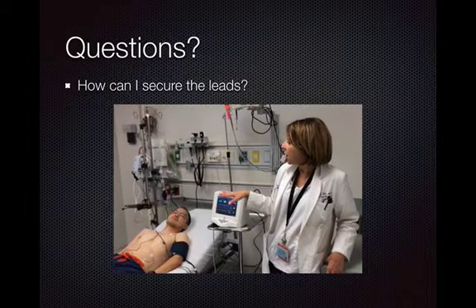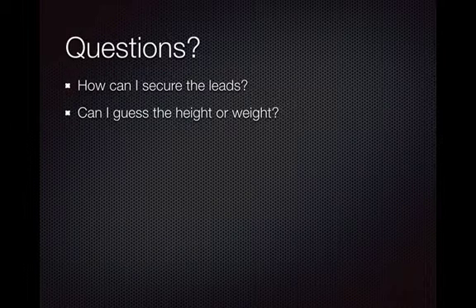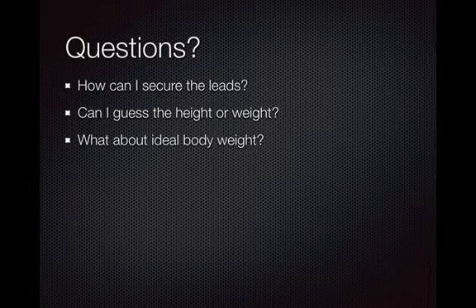Great, thanks Dr. Stein. Next question is, can I guess the height or weight? Ideally you should have a measured height or weight, but patients are going to be septic and maybe unresponsive. You may not have the time, so you can just visually estimate the height or weight. Or, if the patient has family members nearby, you can ask them about their approximate height or weight. What about the ideal body weight?